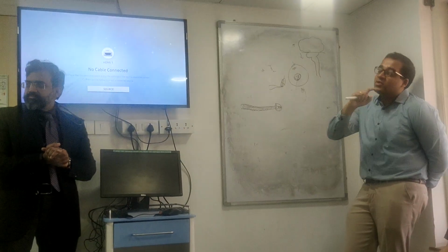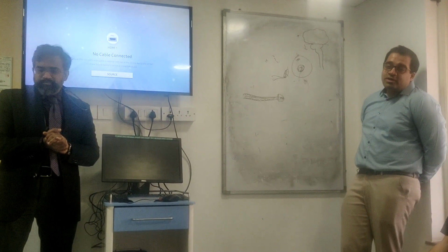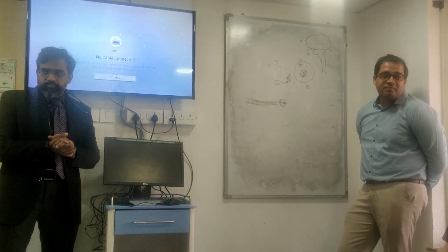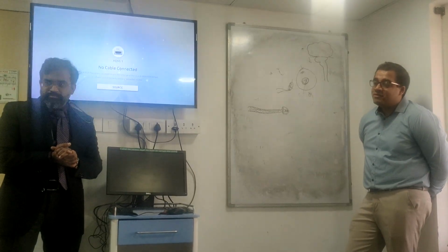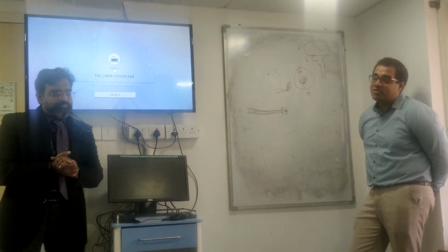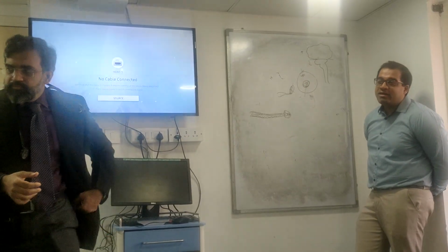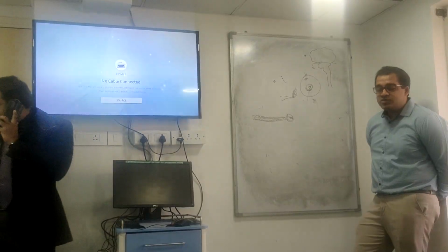Now in the culture bottle, there is one more way. Does Candida grow in this, or do you need to send a separate fungal blood culture? You send urine fungal culture, you send everything as fungal culture. So blood culture you send suspecting Candida. Urine में Candida है. Candida grows very well.